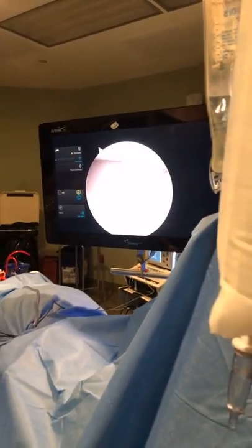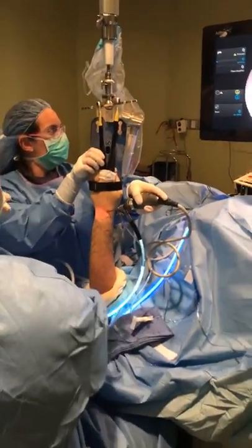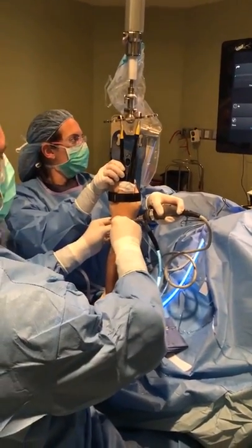Small incision. So these incisions are called portals. In fact, they're so small, we're not even going to put a stitch in them when we're done. No stitch, no scar.